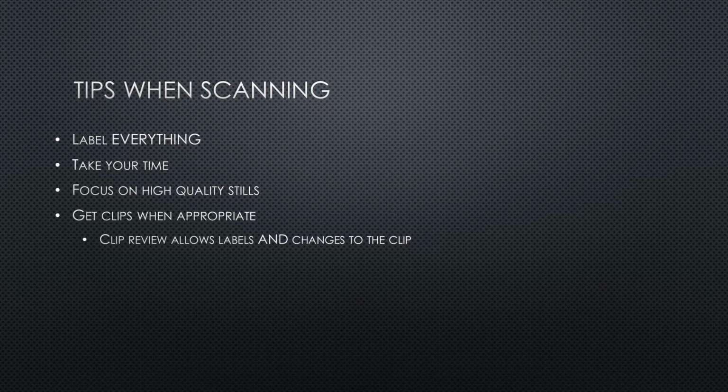And like I said before, you can change the start and stop position of the clip, to make it longer or shorter. So really, you can get exactly the story out of the clip that you want to get every single time. And then if you see pathology, take lots and lots of pics and clips.